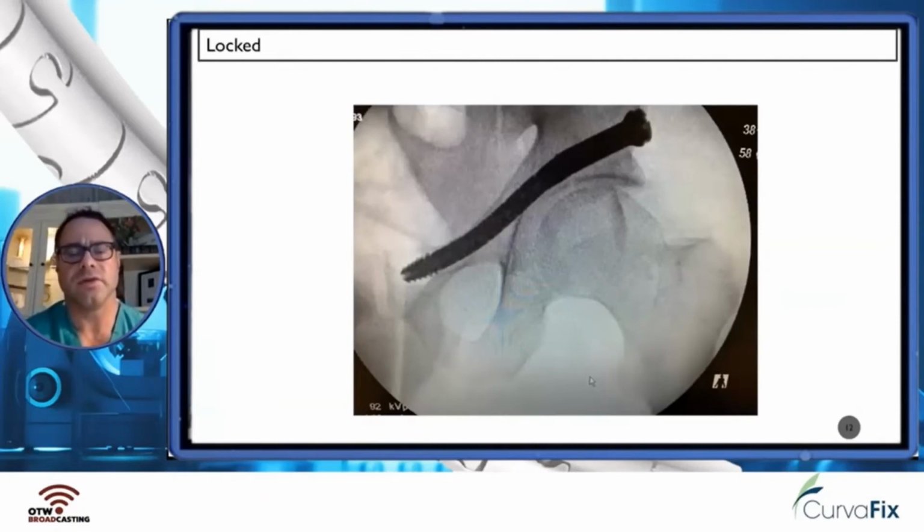The clamp was removed, and then this curved implant that is stuffing the bony corridors, as was described by Dr. Meek, is in position and is now no longer flexible but stiff, and is completely filling this pathway and therefore maintaining this reduction which was obtained.